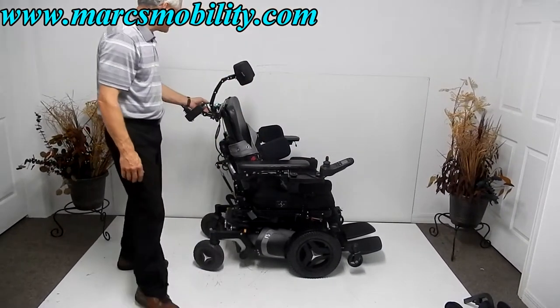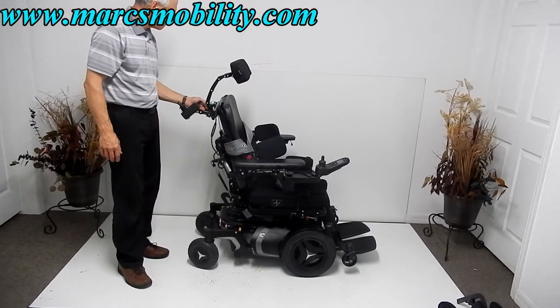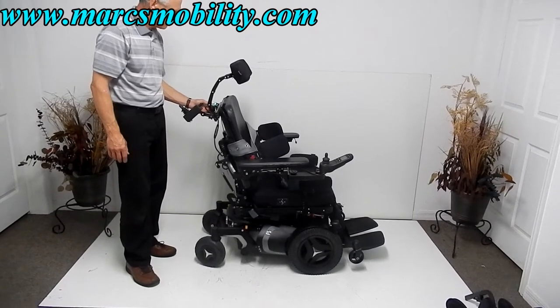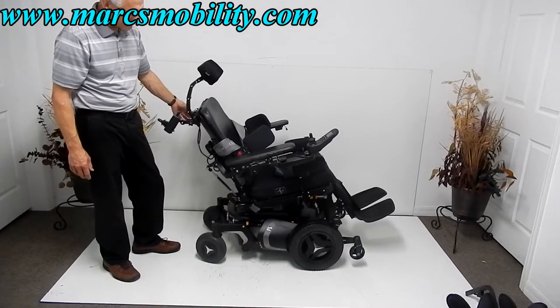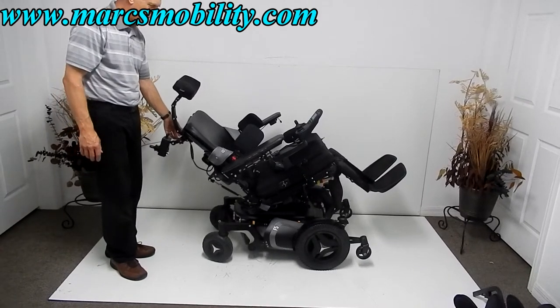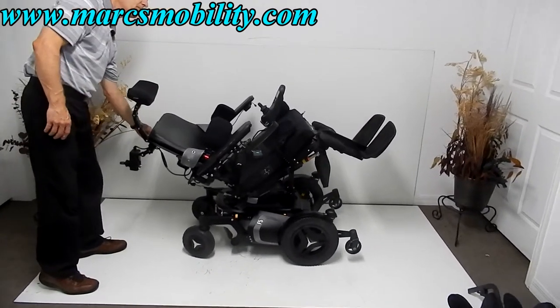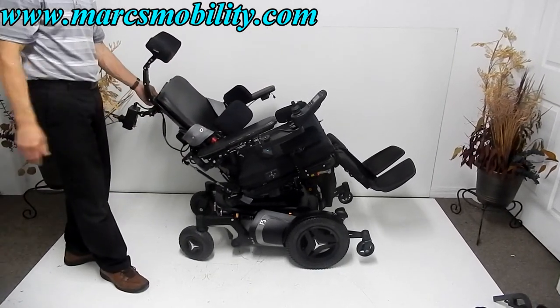Next I want to show you the electric tilt. Some standing chairs don't tilt very far, but this one goes quite a bit. This is the full electric tilt. I can also control all these functions through the joystick if I want to, but it's quicker from the control box.